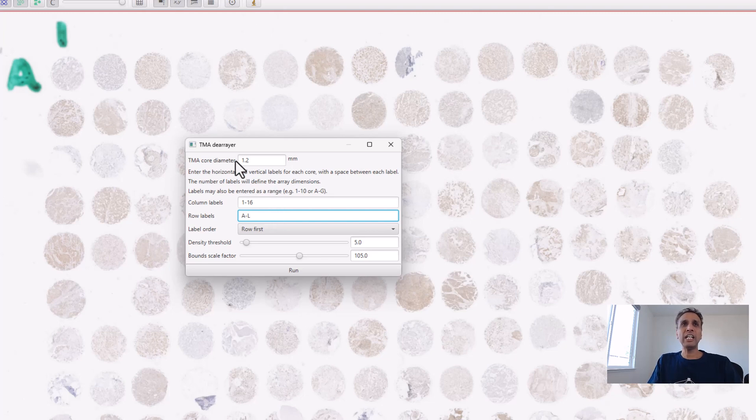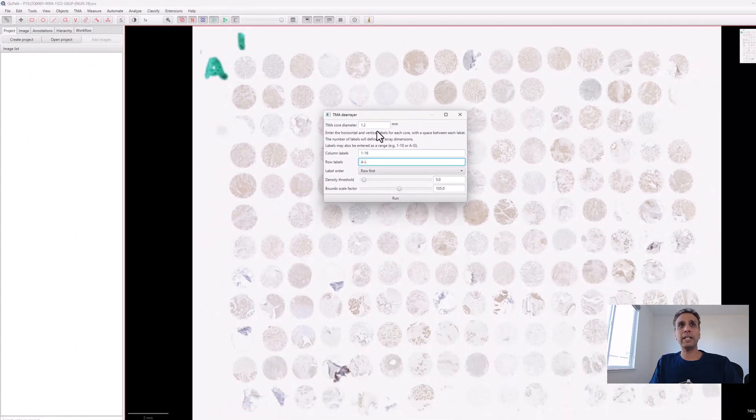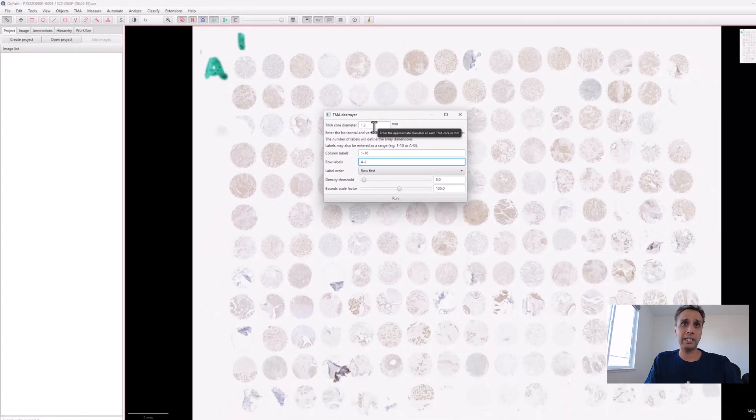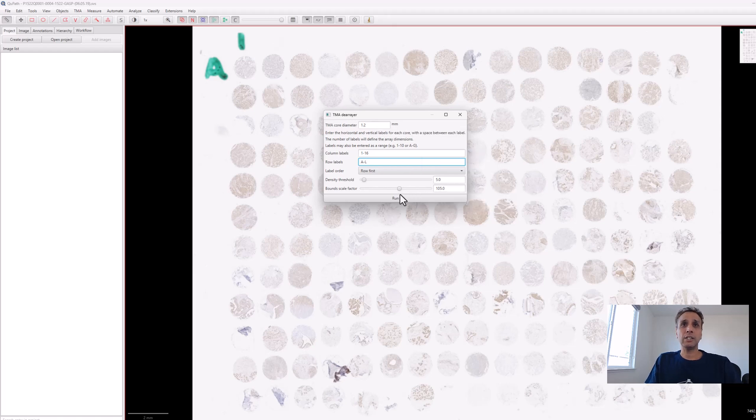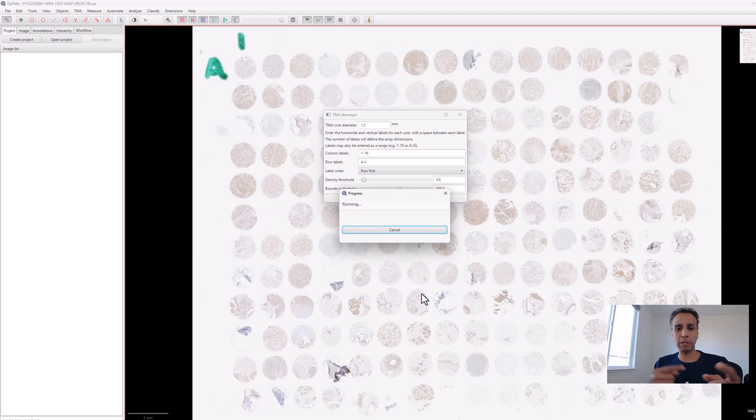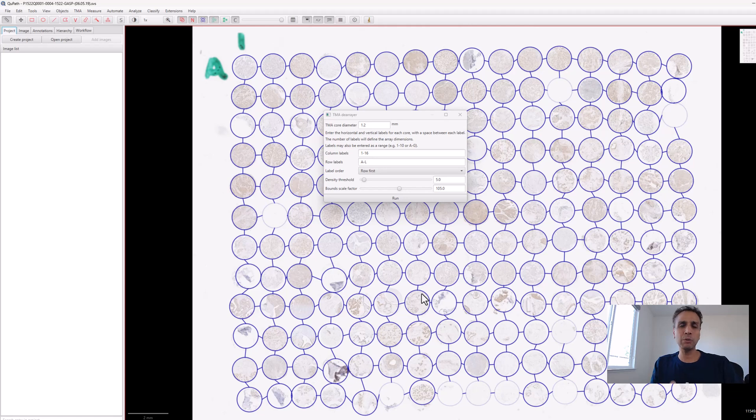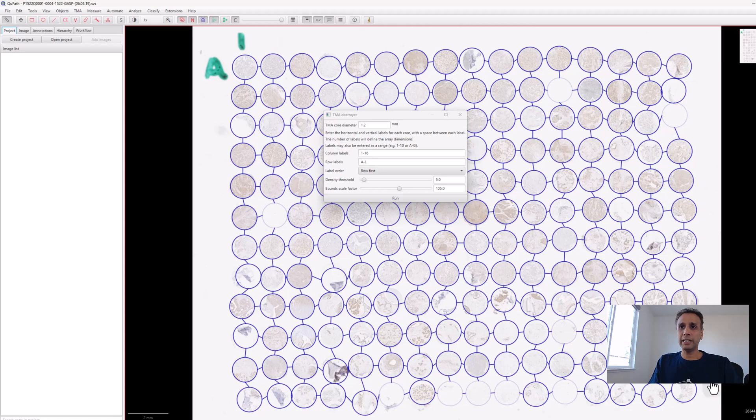It did an amazing job except it didn't pick up the 17th one in this row. You can set 17 and ignore the empty ones, but I'm happy with 16. It didn't pick up some because there isn't enough contrast.